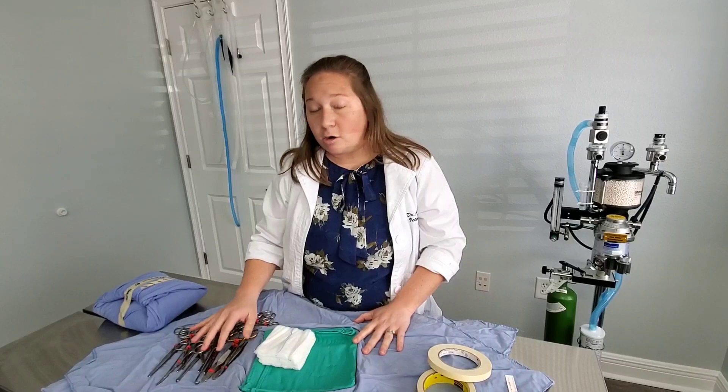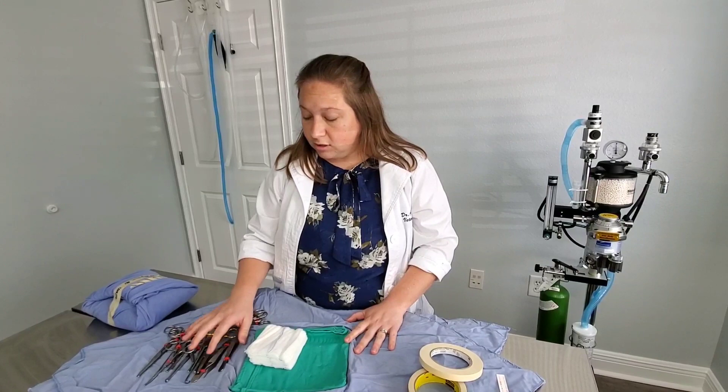This is a surgery pack in a nutshell — most of the instruments we use every day. These instruments are very expensive, so we have to maintain them, take good care of them, and have them sharpened. Ours are German surgical instruments, which are some of the best in the world, and they can last decades if you take really good care of them.